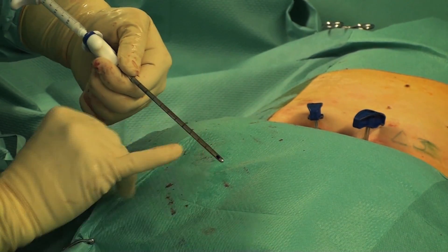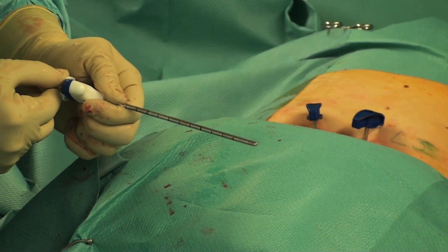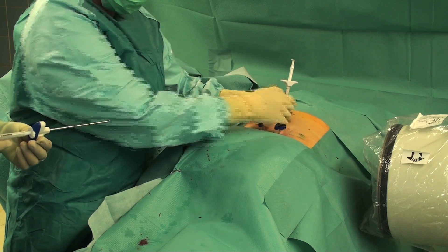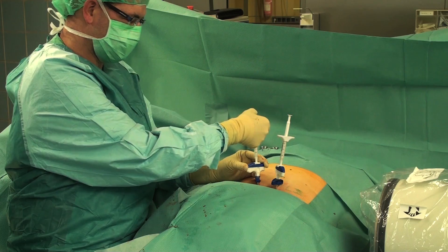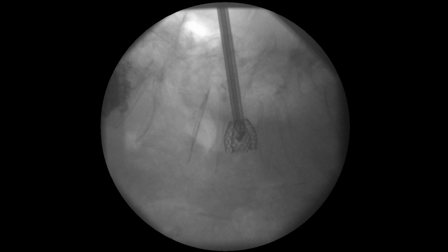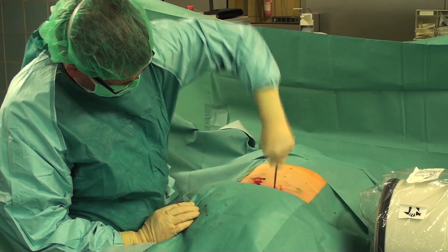A further innovative development is the side opening cement injection cannula, designed for safer cement injection. The injection opening can be closed and reopened by turning the inner sleeve against the outer sleeve, allowing a safer and more controlled cement injection while also orienting the cement flow. The cement injection needs to be constantly monitored under lateral and AP fluoroscopic control to avoid inappropriate cement leakage. The injection cannulas are positioned centrally inside the stents and the stents are filled with PMMA bone cement under constant X-ray control to increase the stability of the whole construction. Afterwards, the injection cannulas are removed.